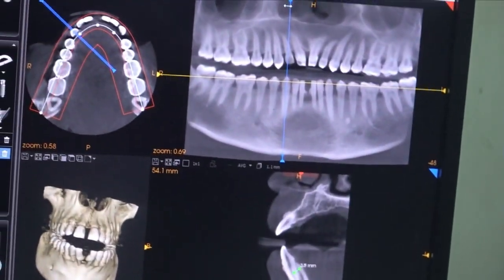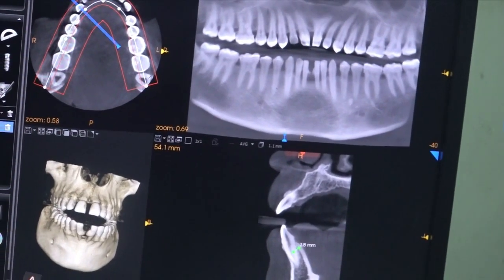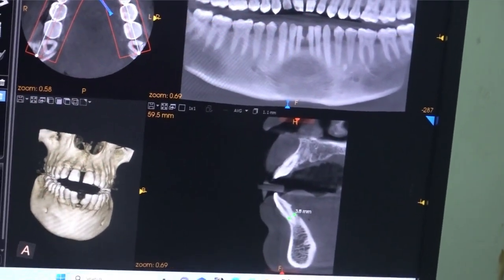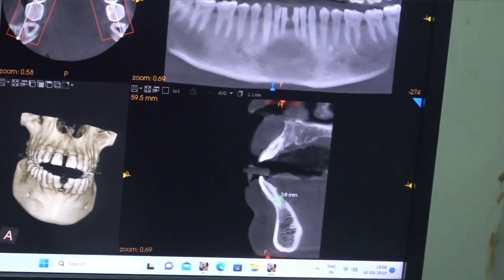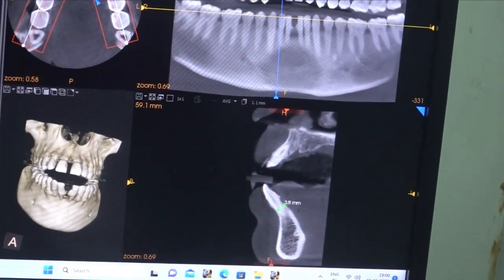If I am extracting a canine, we will do 4.2 because the socket is wider. If you put 3.75, you won't get stability. Okay. So socket width determines the diameter, along with the quality of the labial bone. Okay. So 3.75, 18 or 16 or 18 will be better.